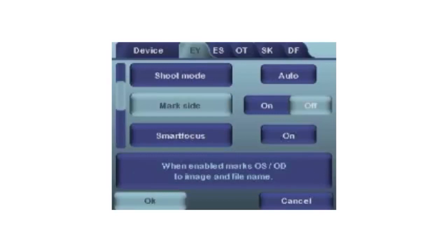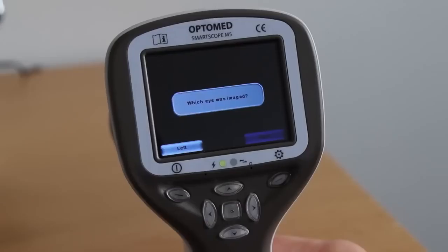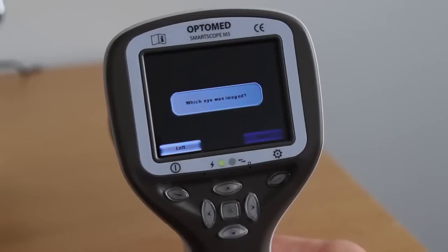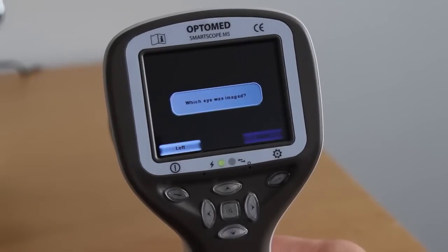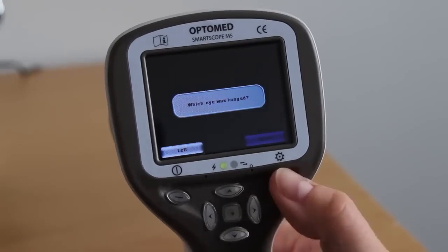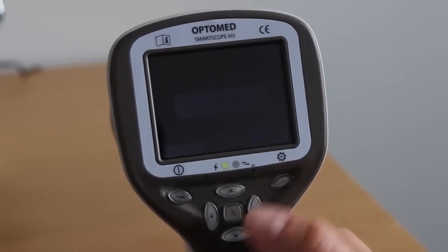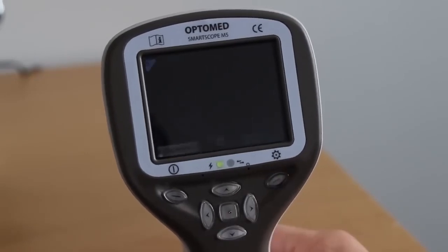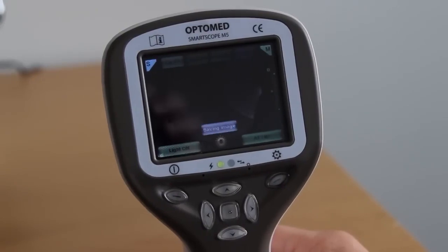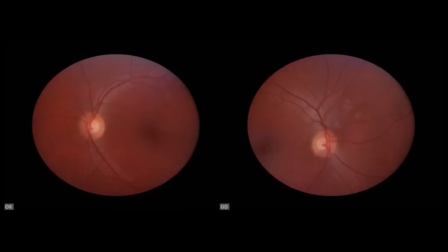Mark side: After each image, it is possible to mark which eye was examined. Marking side feature is enabled from the EY menu. When enabled, the camera will prompt the user to verify left eye or right eye after the captured image. The side is marked to the file name and the image with the identifiers OS for left eye and OD for right eye.